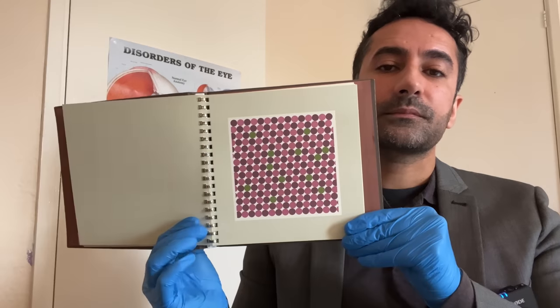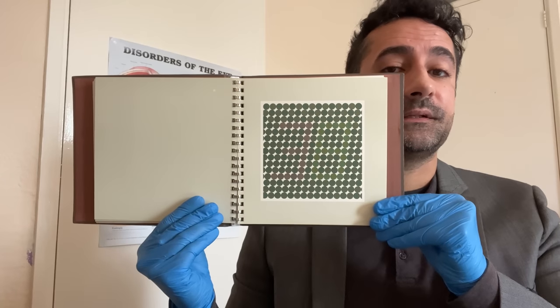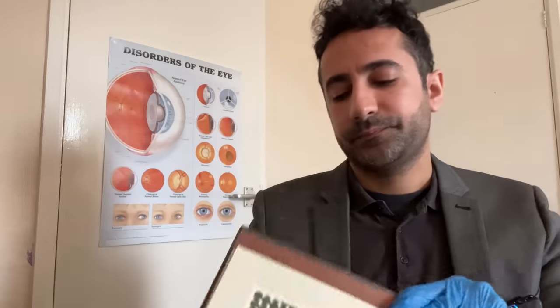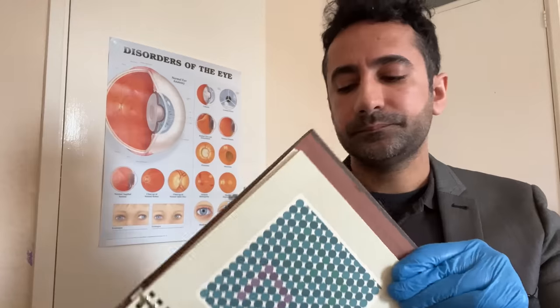We'll go a little bit slower, we have plenty of time today. Let's see if you can find the final demonstration plate, number 4. Now we're on to the screening plates, all the way up to number 14. If you see two numerals on the plate, tell me which one stands out the most — say what you see and then say which one potentially is more vivid. This is plate 6 and plate 7.